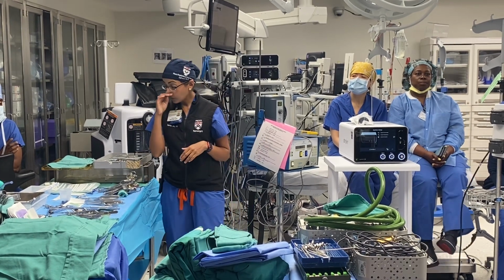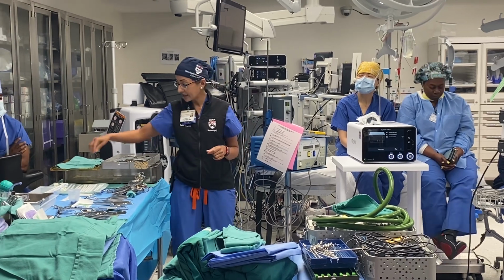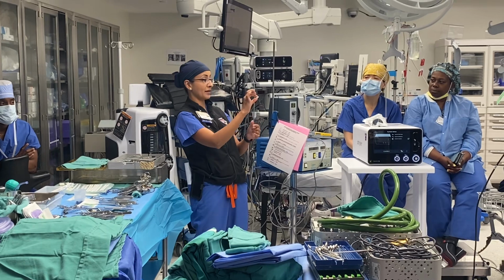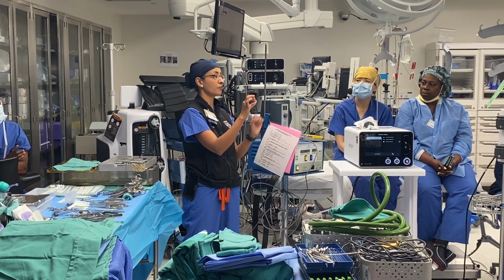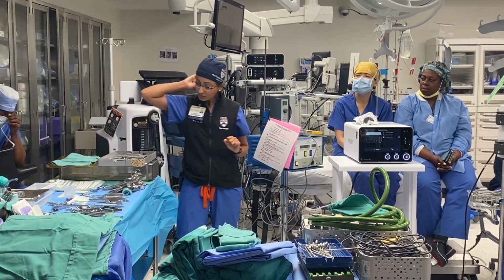And then, again, once we're inside the head, bleeding is always something we don't want inside the head. So we're doing things like tiny pieces of Gelfoam. This is already small, but guess what? We cut that into basically quarters when we're inside the brain, okay? So we'll sort of do that.